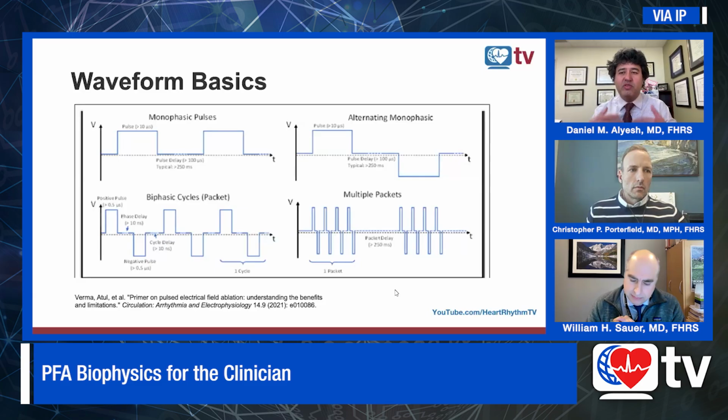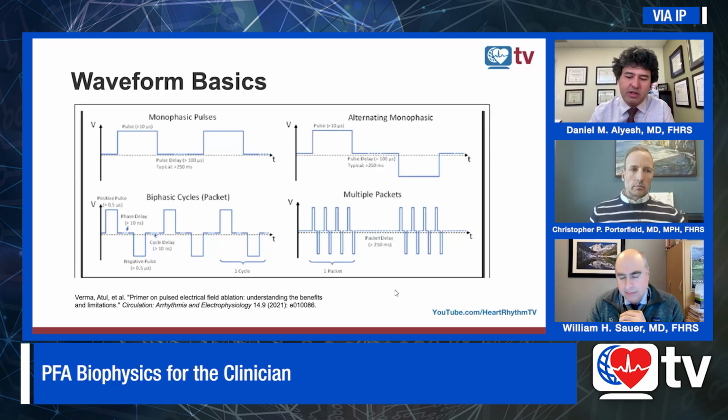And I think improving our understanding honestly unlocks our understanding as EPs, because I think in the world of RF, we like to toy with power, duration, irrigant, contact force, and that's been kind of, at least for now, lifted from us. So, well, thank you for that great discussion.